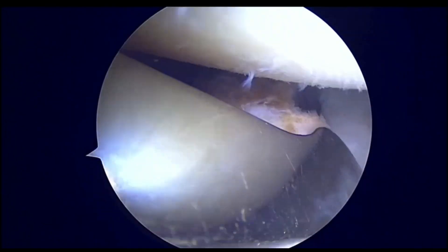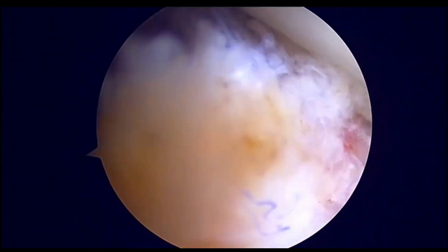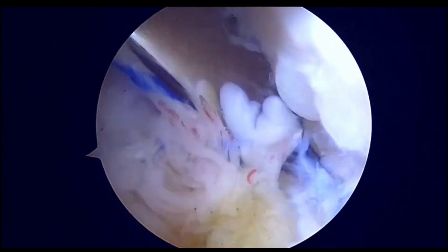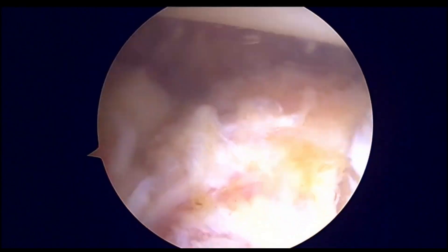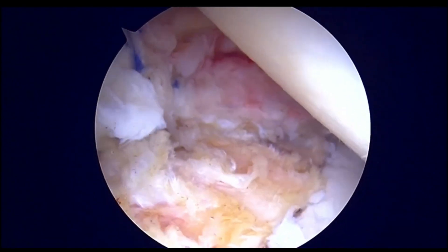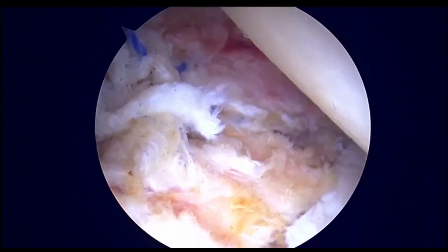You can use a liberator to actually place the bone block into the correct position. You can identify the button on top, and then use the liberator to elevate the labrum so that the bone block can be placed into its place. You can see that the bone block is now absolutely flush with the glenoid surface. We can then cinch the fiber tape system, tighten it, and fix it over the glenoid neck.